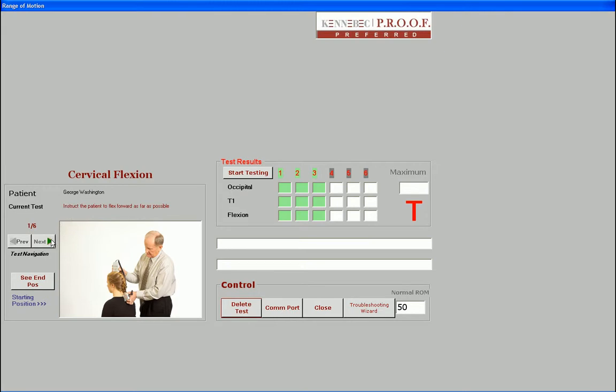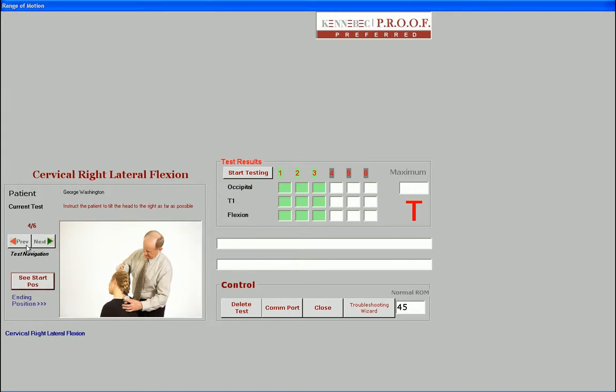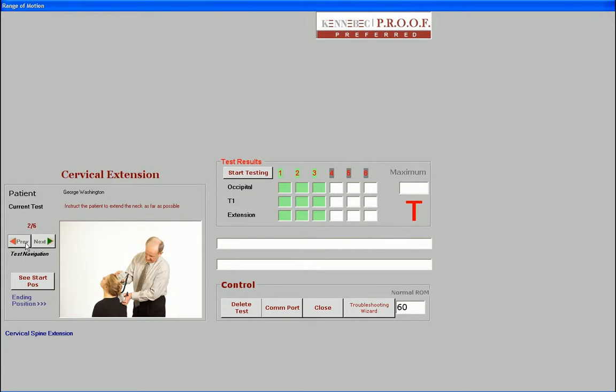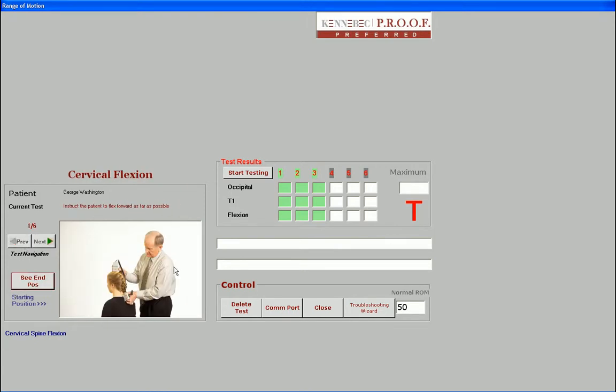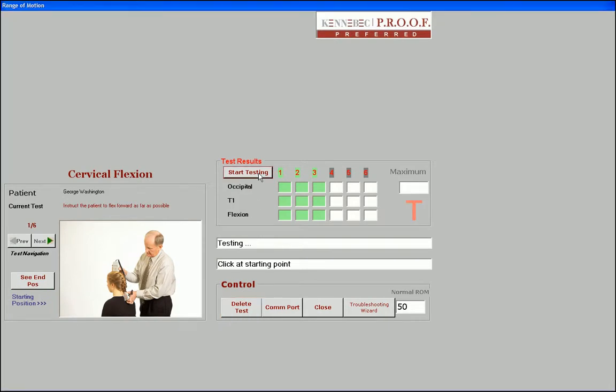You can also preview all the tests you wish to take by simply clicking on the right and left arrow buttons. There are separate pictures for starting and ending position for each range of motion test. Let's click on Start Testing, which will allow the system to go into live testing mode.